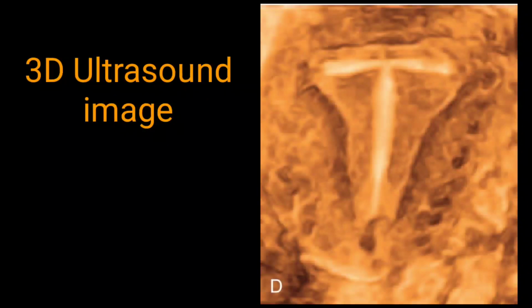If you are doing 3D ultrasound imaging, it will show you all 3 dimensions. So here in one image you can appreciate the endometrial cavity clearly. Within the endometrial cavity, this copper T is properly placed. A copper T or any other intrauterine contraceptive device should be in the upper segment of the uterus. If it is low lying or in the cervical region, it is likely that both arms would be embedded within the myometrium. So there is a chance of perforation.